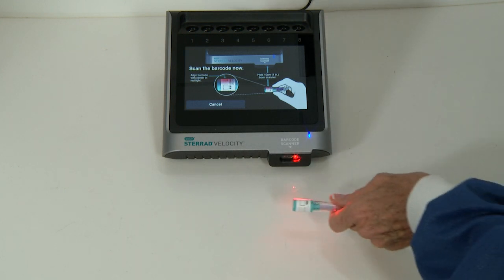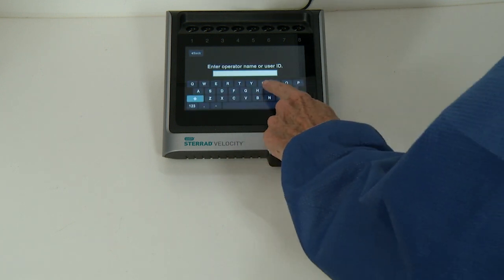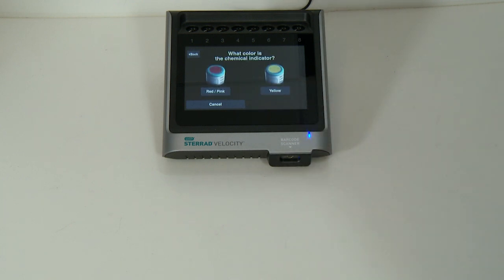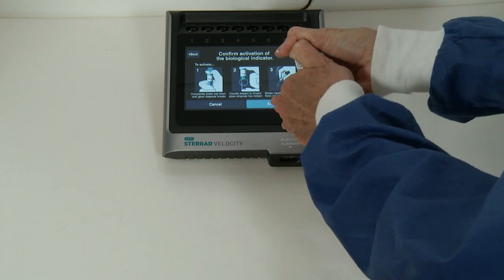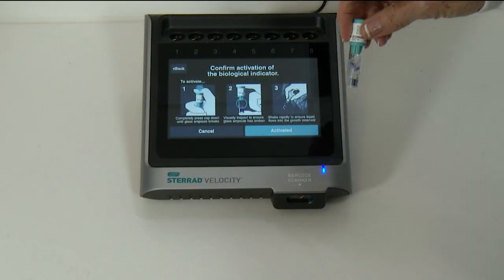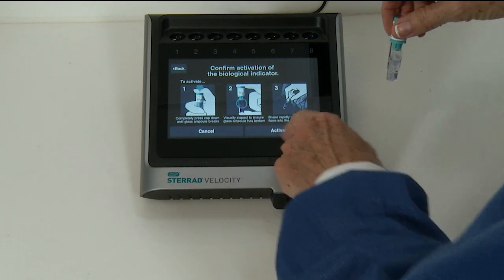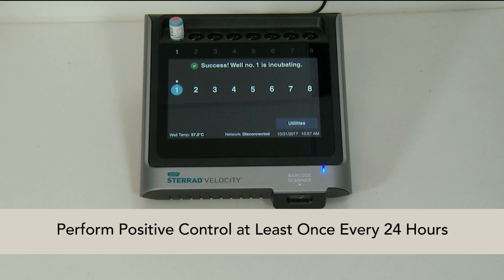Scan the barcode on the cap label using the barcode scanner located on the front of the reader. Then enter the operator's name in the space provided or select the operator's name from the list. If configured, an optional screen prompt will ask the operator to visually confirm the color of the chemical indicator located on the cap. Activate the BI before placing it in the reader: completely press the cap down until the glass ampule breaks, and visually inspect to ensure the glass ampule has broken. Shake rapidly to ensure liquid flows into the growth reservoir. Failure to do so may result in incorrect reading. Finally, place the Control BI in the selected reader well. Test results will be available in 30 minutes. A new positive control must be performed at least once every 24 hours using a biological indicator from the same lot as the test indicator. The test results are considered invalid if there are no positive control results.